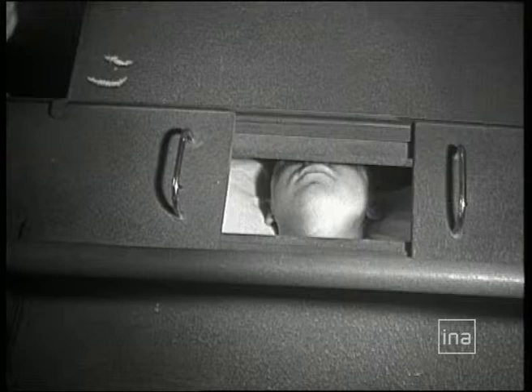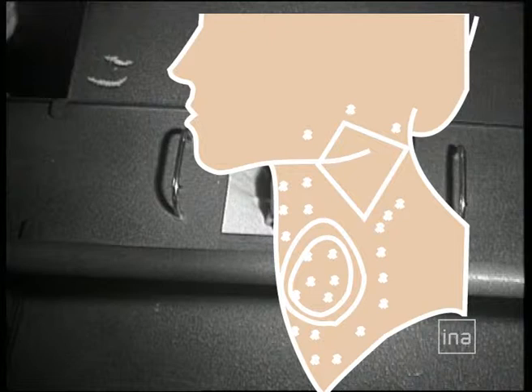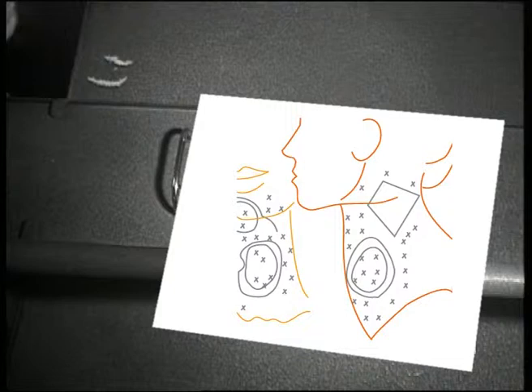The levels of radioactivity are initially recorded manually on a drawing. So functional images are obtained rather than anatomical images, as they show how the thyroid had taken up the iodine.